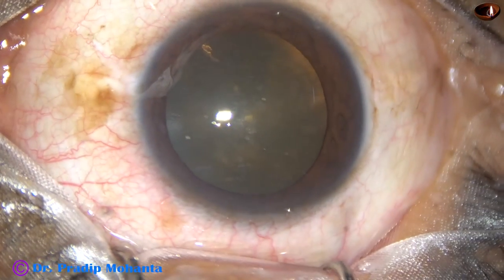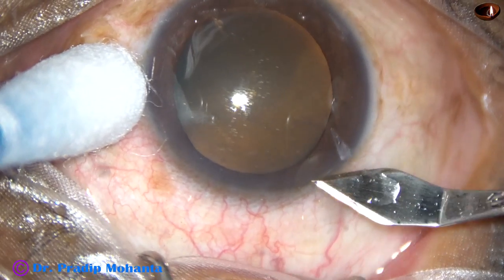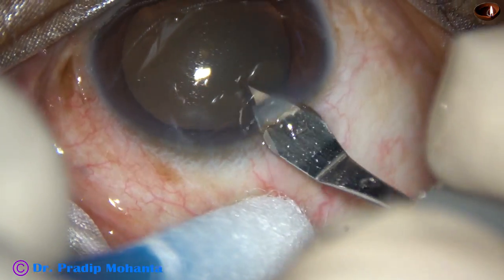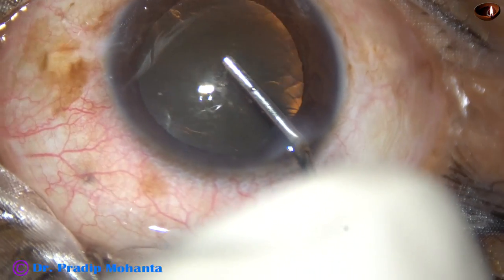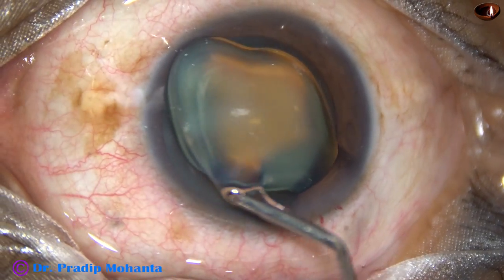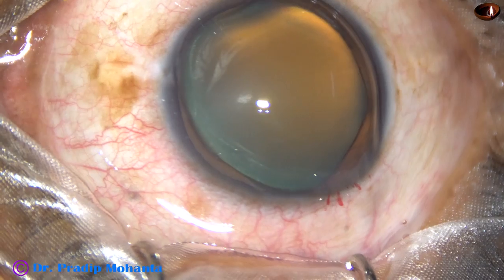This patient has mild cataract with moderate non-proliferative diabetic retinopathy. Our retina consultant has suggested cataract surgery along with intravitreal injection of anti-VEGF. So, I have taken out this case for surgery.